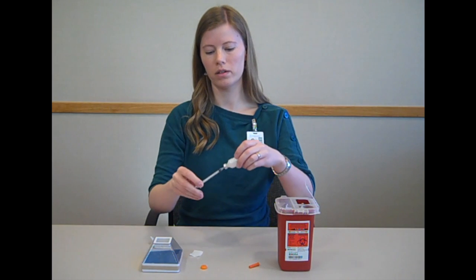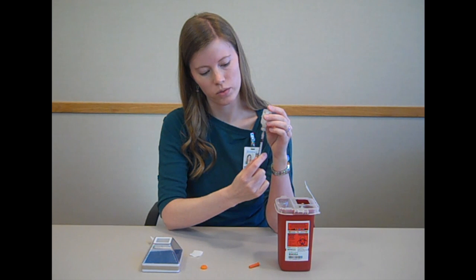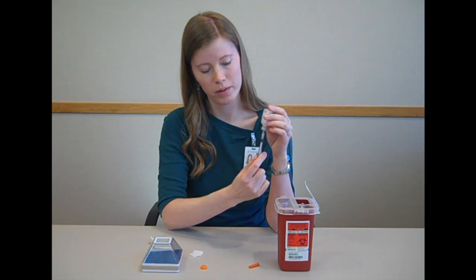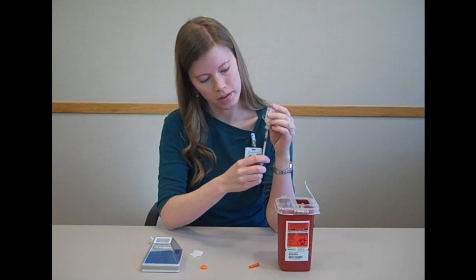Turn the whole thing over, and then pull the plunger back to 20. If you have bubbles in the syringe, you can pull past 20 and then push back up to push the bubbles back into the vial.